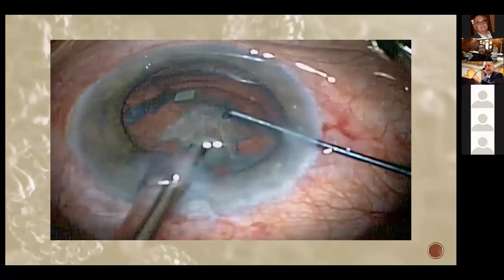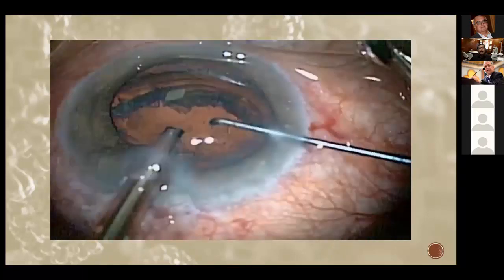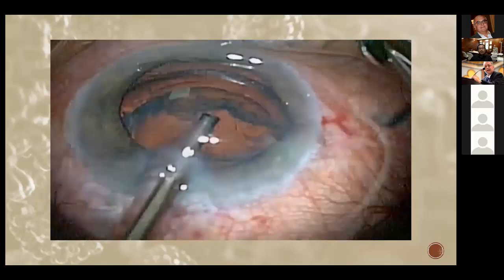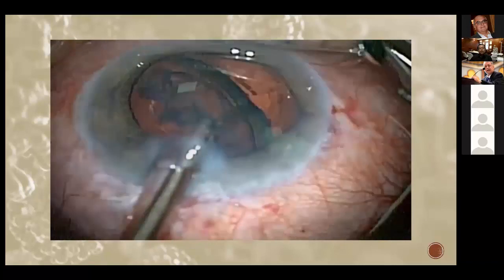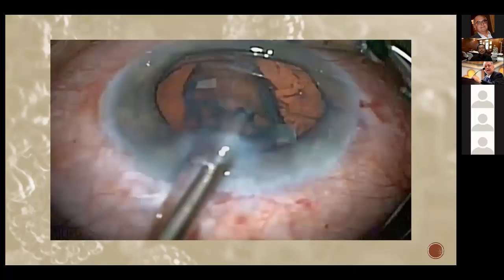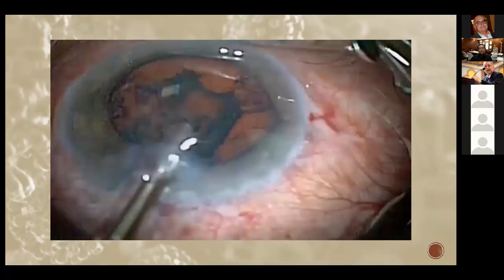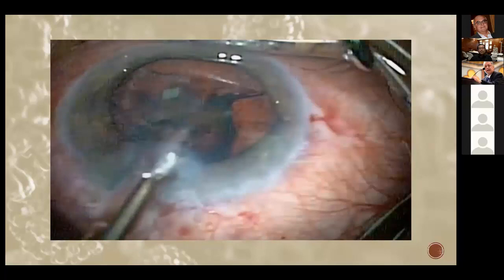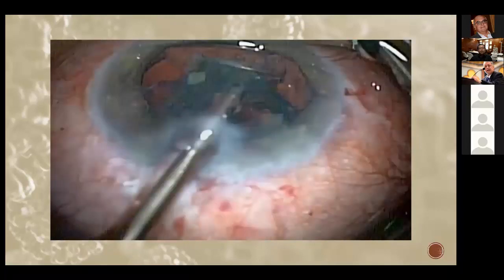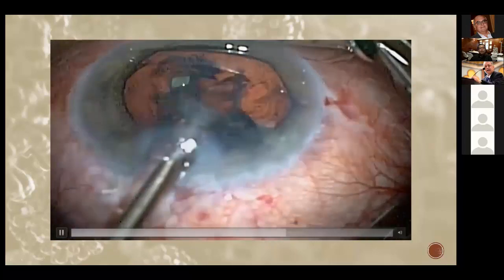And then as you can see, the bag is stable, but the epinucleus wants to come, and that's easy. I take out my side port instrument to make sure that the fluidics are tightly moving towards the phaco tip and nothing is leaking. And as you can see, the epinucleus is coming to me easily, very easily, no problem. And the bag is stable in its place. You can see the bag is totally stable.